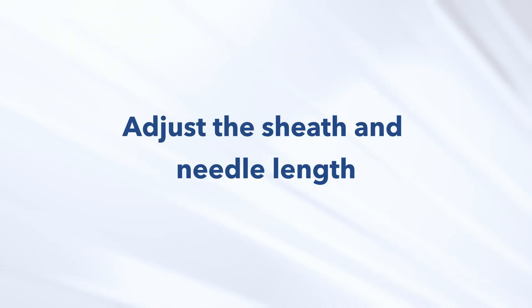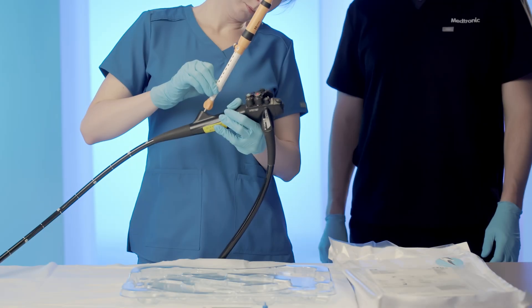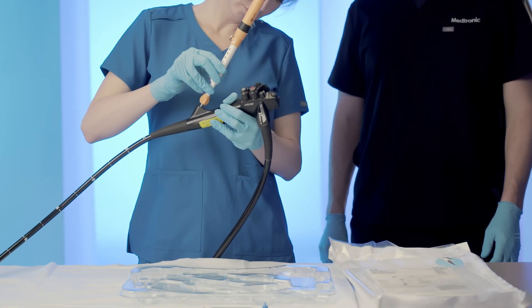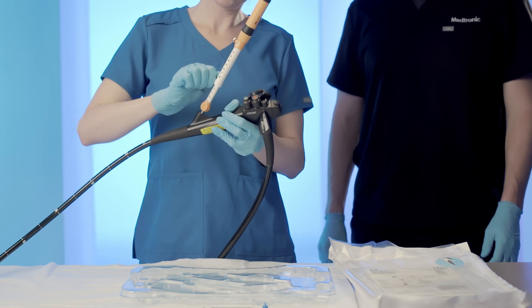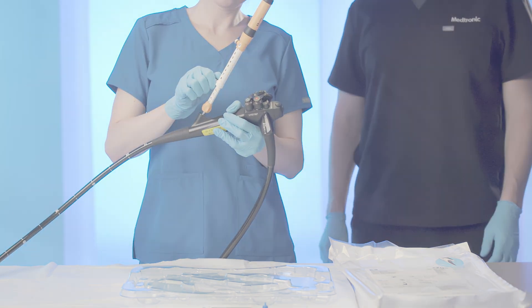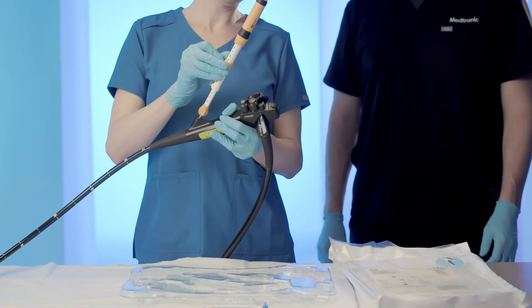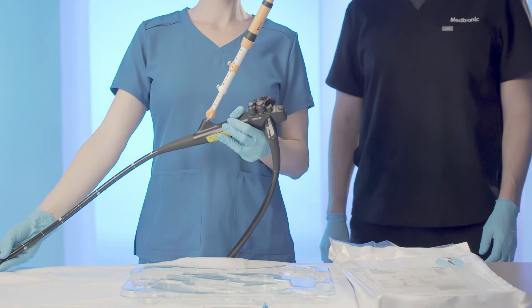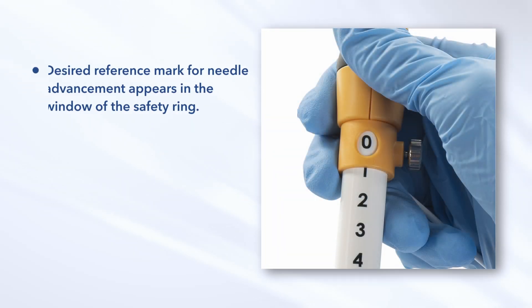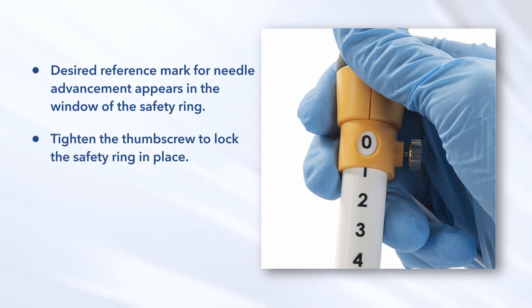Adjust the sheath and needle length. Determine the preferred sheath length depending on the endoscope being used. Loosen the thumbscrew lock on the handle sliding member and slide until the preferred length is attained. Tighten the thumbscrew to maintain the preferred sheath length. Adjust the needle to the desired extension length by loosening the thumbscrew on the locking safety ring and advancing it until the desired reference mark for needle advancement appears in the window of the safety ring. Tighten the thumbscrew to lock the safety ring in place.